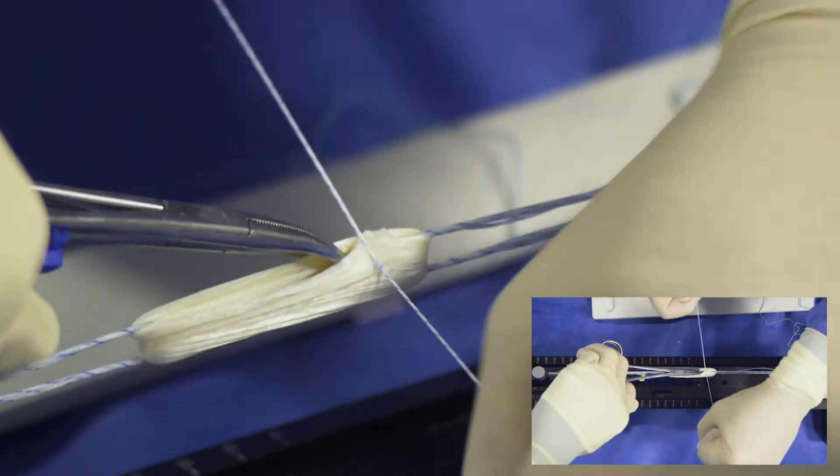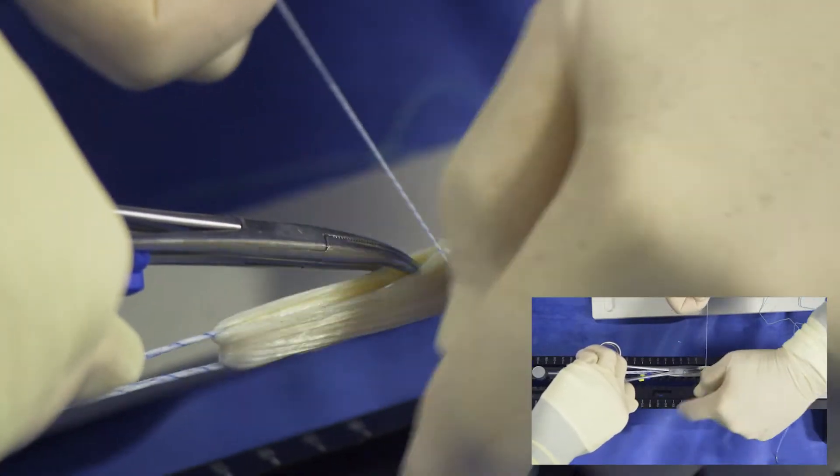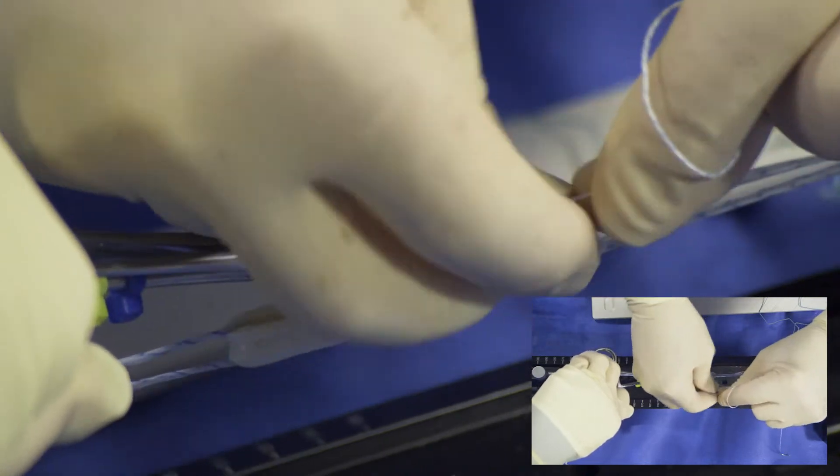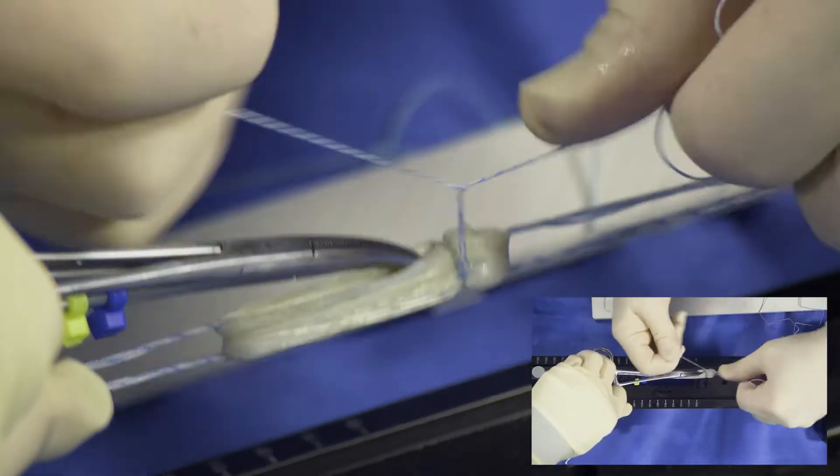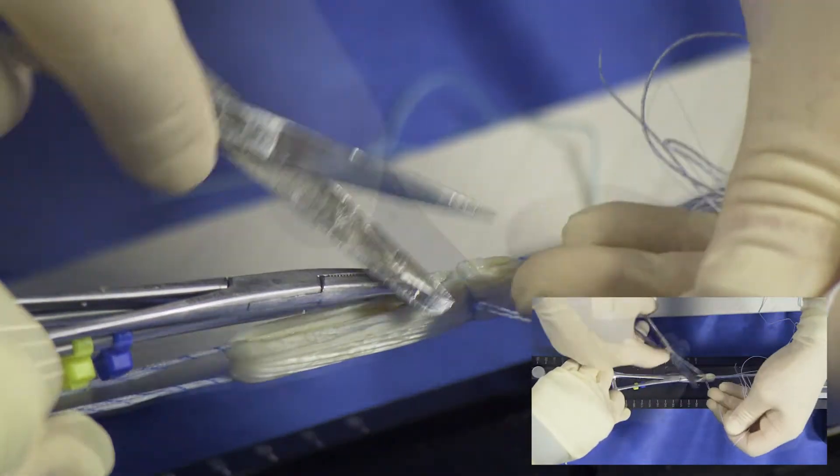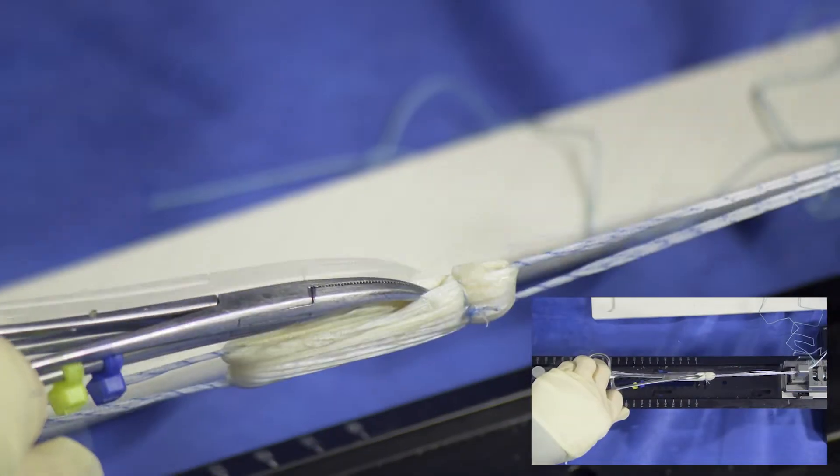I like to cross in the tendon and then tie one knot and wrap around the tendon in order to package it for implantation. This is typically repeated two or three more times.